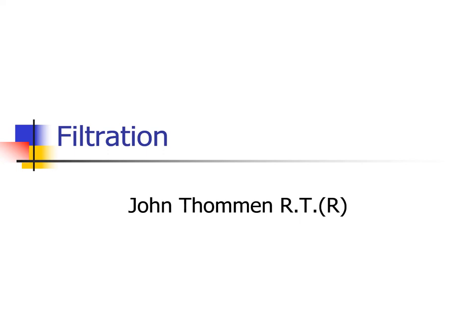In this video, we will explore the reason for why we filter the X-ray beam and filtration's effect on the finished image. Most general purpose X-ray machines are required by state law to have a minimum of 2.5 millimeters of filtration in their tube collimator assemblies. Why is that?